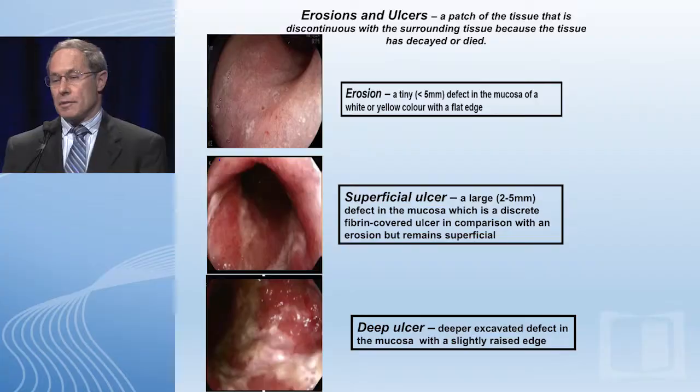So that wouldn't be free blood, or there might be a tiny bit of free blood called mucosal bleeding. There may be luminal bleeding, a very small amount, a luminal mild, or on the bottom, and I'm going to show you a video of the lower case shortly, that is luminal moderate or severe bleeding where there's frank bleeding ongoing during the procedure.